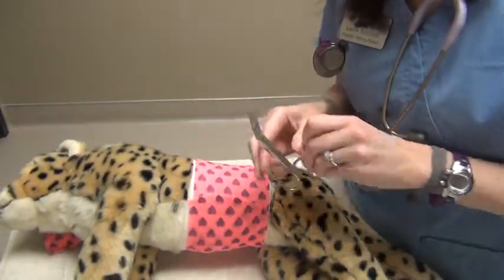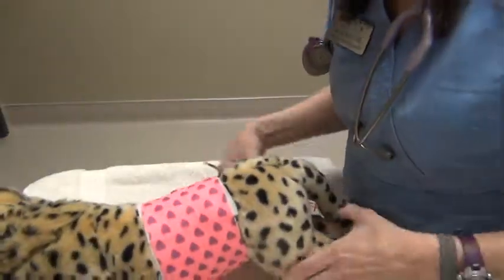Now we're going to go ahead and remove the abdominal bandage. To do that, you always want to be safe and cut where you can see.